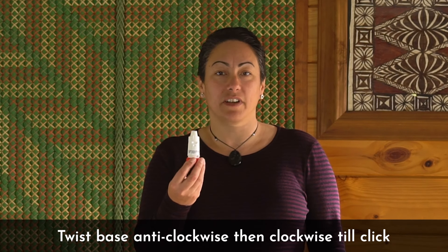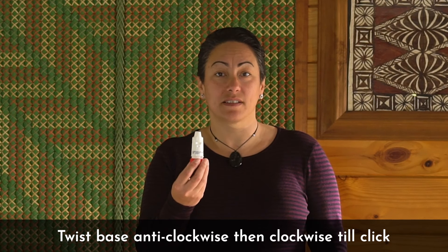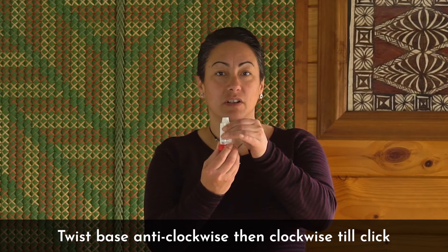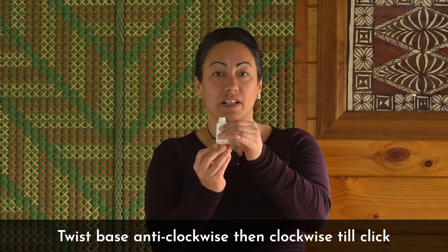Next, you'll need to activate your dose. To do this, twist the base first anti-clockwise and then back to the start.